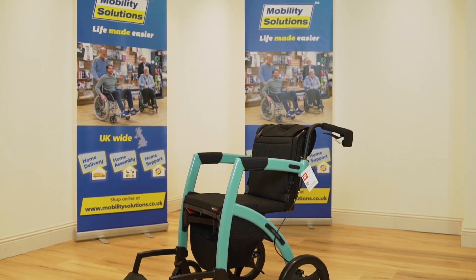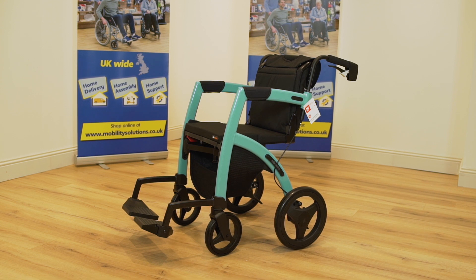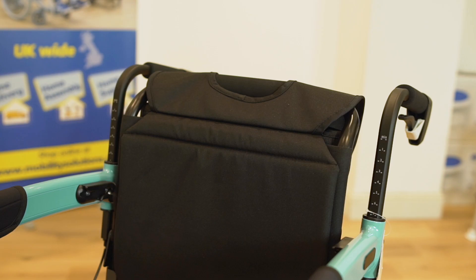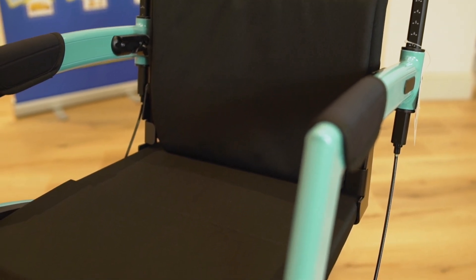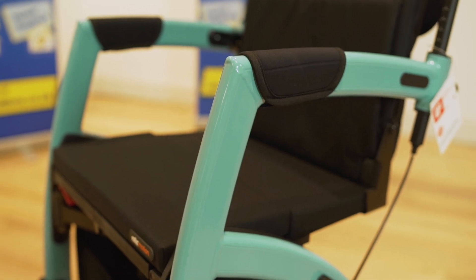With a supportive and strong frame, the Rolls Motion 2 allows the user to walk in comfort while also benefiting from the ability to transform into a wheelchair when required. It is available in two sizes: medium for users up to six foot two and small for users from five foot two, meaning you can find the most comfortable size.